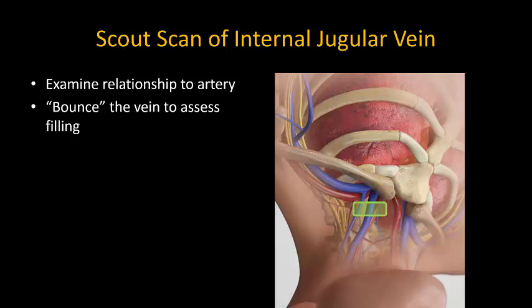The probe should be slid along the course of the vein to assess its relationship to the artery. The probe should also be bounced lightly on the vein to compress it and assess how well-filled it is. It's easier to cleanly puncture and cannulate a well-filled vein, so if appropriate, increase the head-down tilt of the patient to encourage filling.